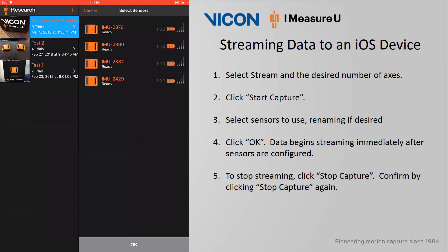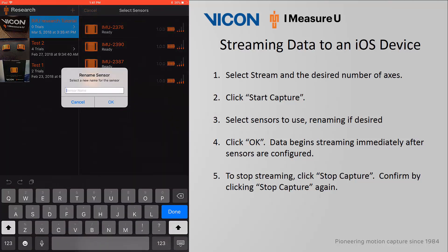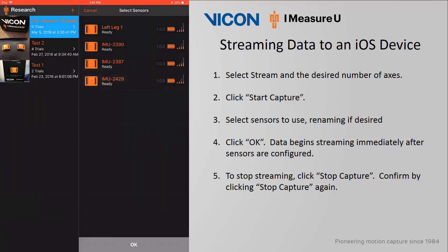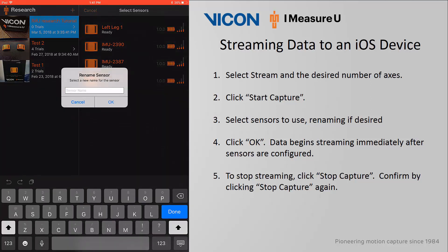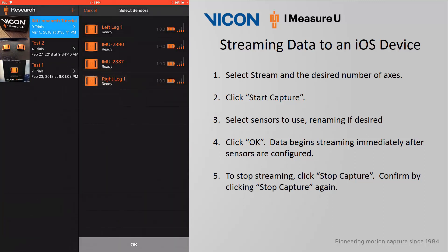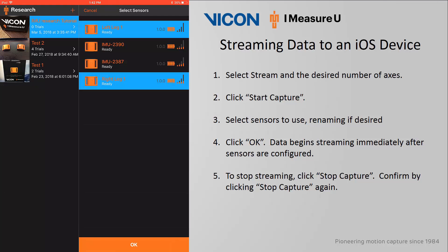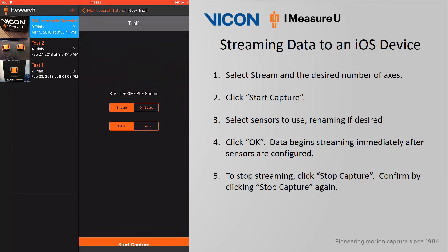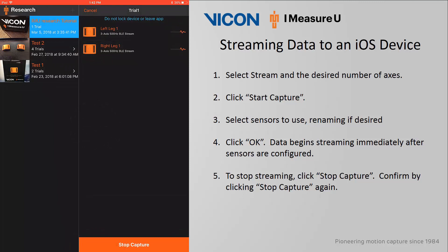When selecting a sensor, you can drag it to the left and rename it to help identify the location of each sensor. I will swipe 2376 to the left and rename it as Left Leg 1, then do the same for 2429 and rename it Right Leg 1. I will select both of them and click OK. Remember, you can choose up to 4 sensors when streaming data. As soon as I click OK, the sensors begin to configure themselves, setting up synchronization. When this process is complete, data begins immediately streaming from all the sensors to the iOS device.